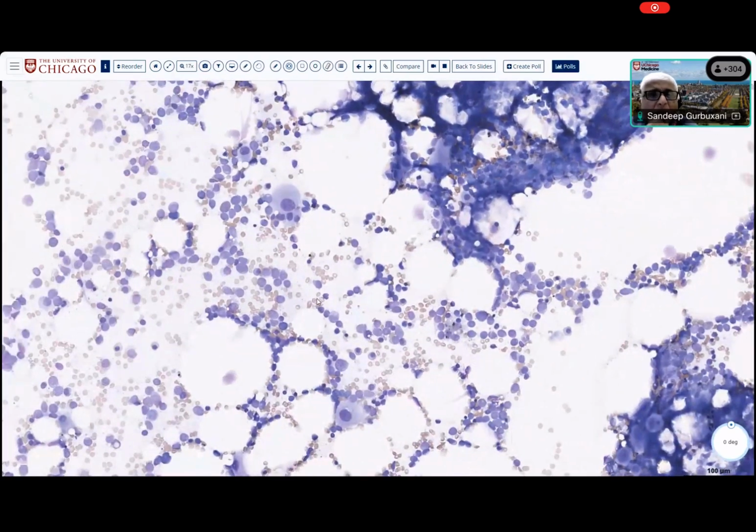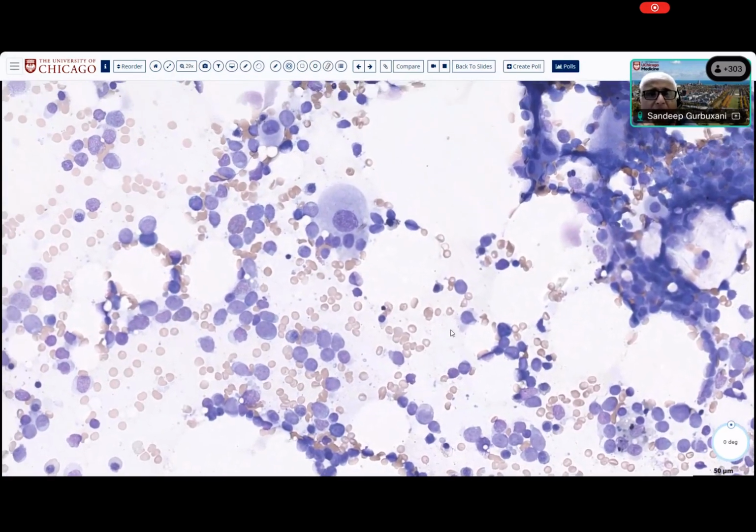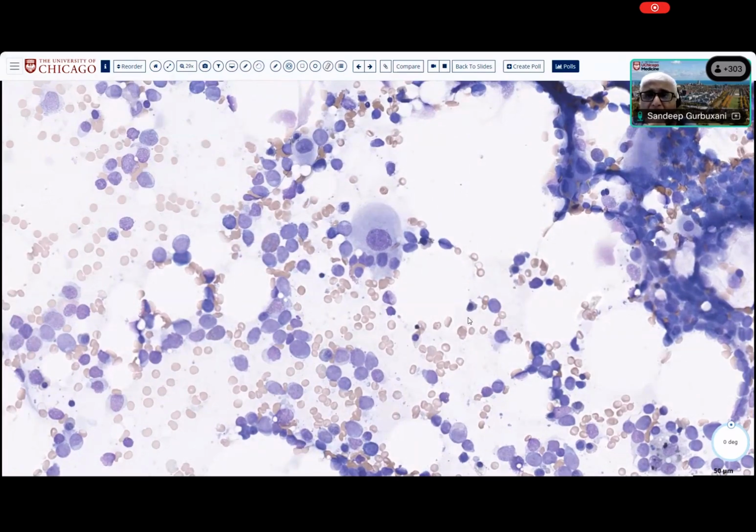So what are some of the features that stand out in this particular case? Does anybody want to put that in the chat? Or should I call on a name? Yojita, do you want to describe this case? Sir, I'm seeing eccentric nucleus with basophilic cytoplasm in the cell. Yeah, okay. Yes, sir.